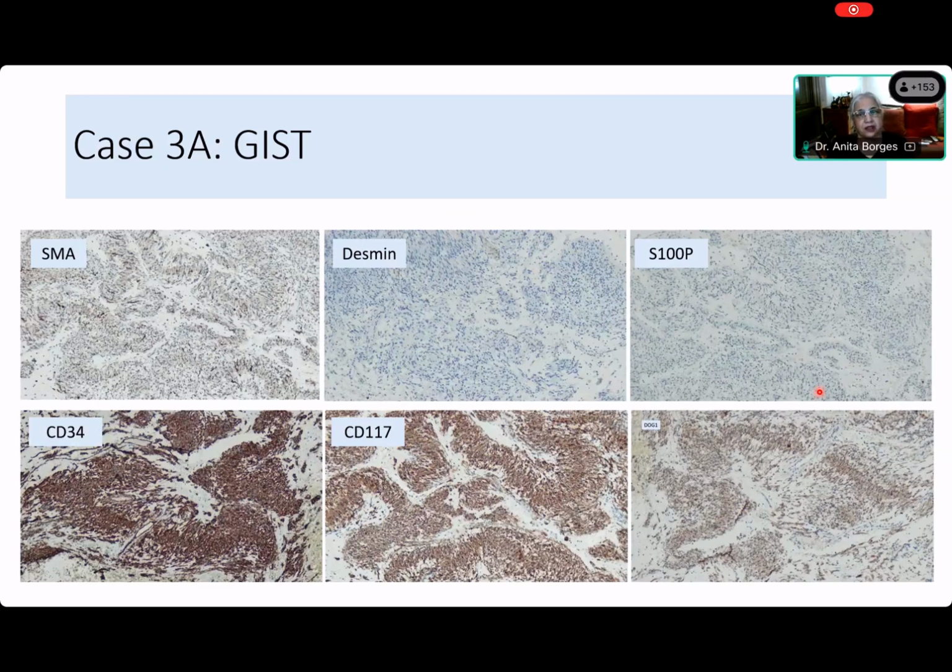Let's read this immunohistochemistry picture. What do you see from left to right, first row and bottom row? SMA: is it positive or negative? Negative. Then what are all those brown things over there? Focally positive. Oh yes, it is positive, and it is focally positive. Okay, it's not weakly positive, it is focally positive. If I can see it from this far and I can see that it is brown, it is focally positive.